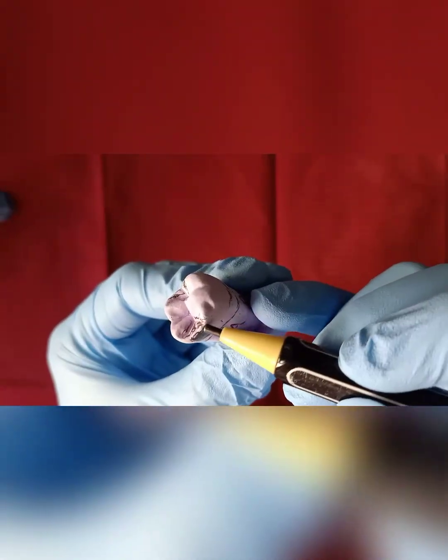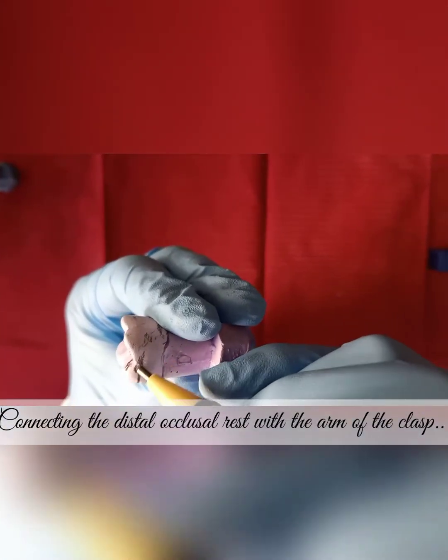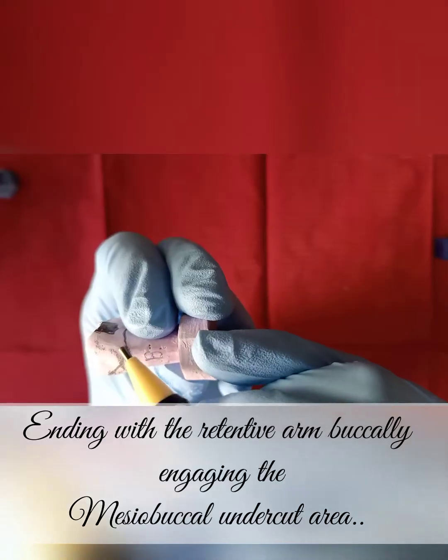Go all around the tooth, all above the survey line, uniform thickness, connect with the distal occlusal rest, and go below the survey line to engage the retentive arm in the mesiobuccal undercut area.